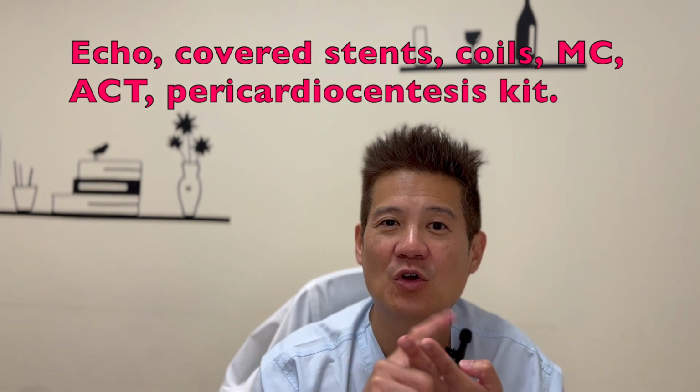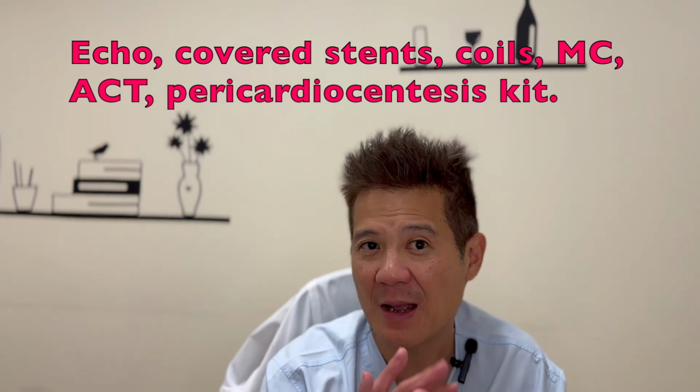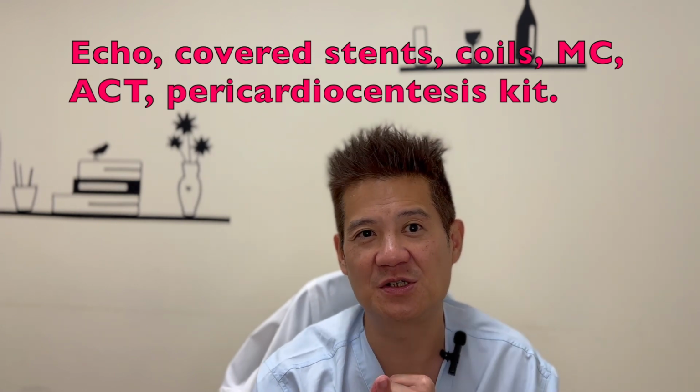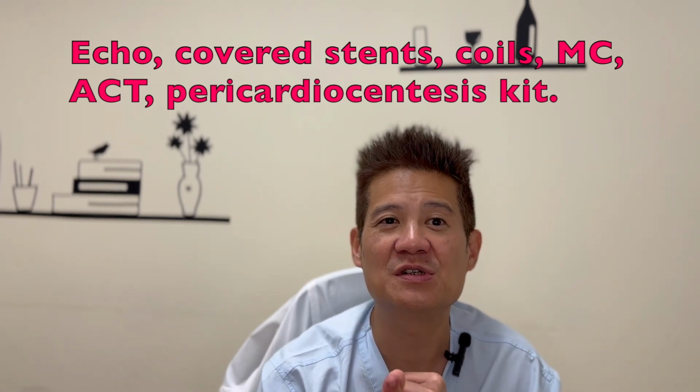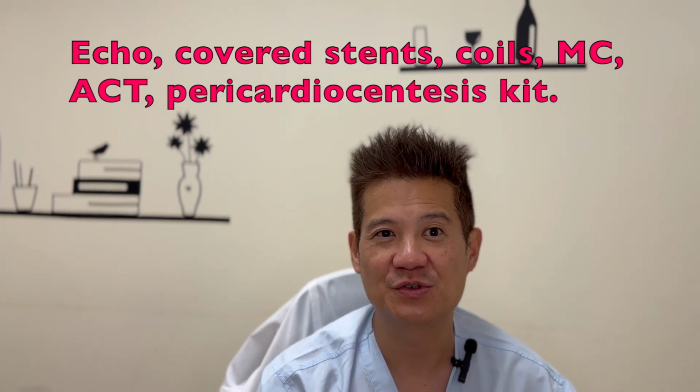Cover stents, coils, and compatible microcatheters for coil delivery, because perforation happens and we need to be able to deal with it in the cath lab. ACT machines, because checking ACT is considered essential for CTO PCI, and a pericardiocentesis set, also essential. These are the 6 essentials that we listed for safe CTO PCI. On the setup, of course, corresponding to these 6 things is a team that's familiar with CTO PCI, with radiation safety, with CPR, because every now and then we need to deliver that, and with pericardiocentesis.